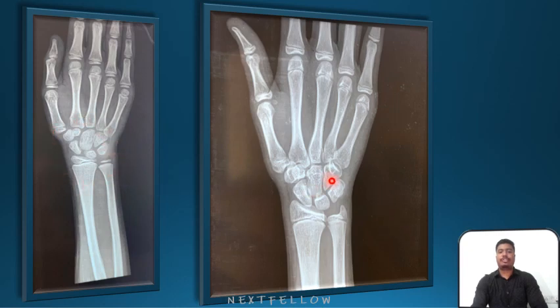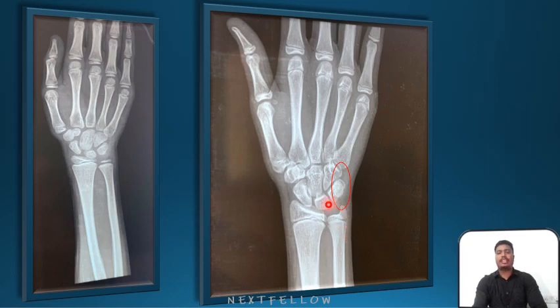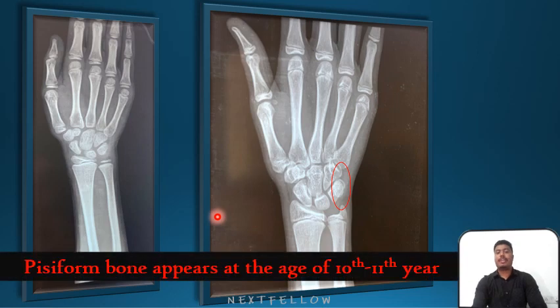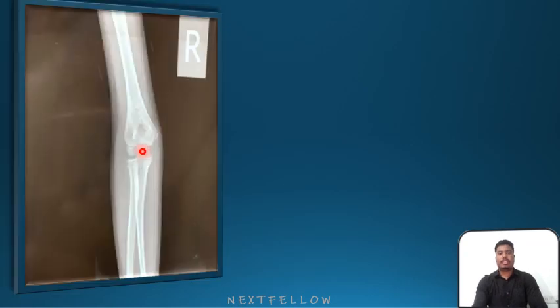Now see these two x-rays — both are x-rays of the wrist joint. Do you see any difference in the carpal bones? The oval I made — you can see a small bone behind the triquetrum, that is the pisiform bone. Pisiform appears at the age of 10 to 11 years. So this x-ray is of less than 10 years, and this x-ray is of 10 to 11 years or more.